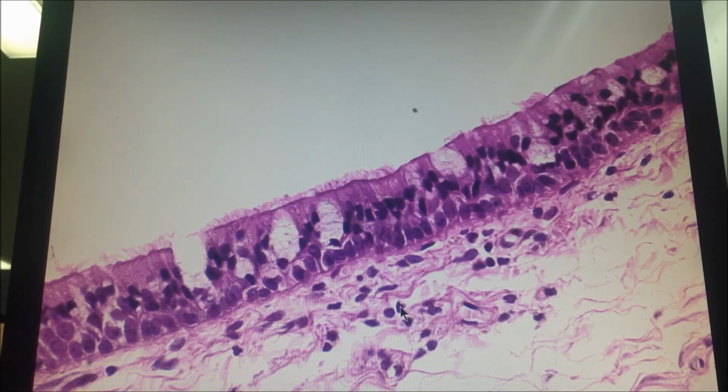Well, actually you can see that clearly. We have a large amount of cells scattered close to each other, clusters. وبتوين them هذا البينكش هذا هو الcollagen. الcollagen مش عامل very thick bundles، في spaces between the collagen. فلو س connective tissue هون، والله بنيجي بنأشر لك على أي cell من هدول.